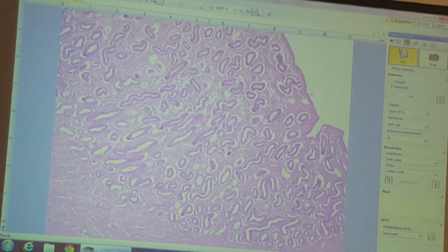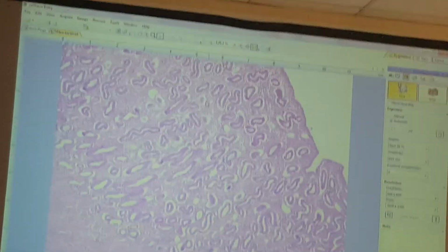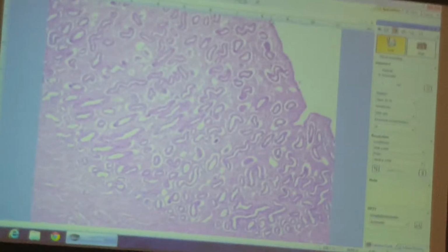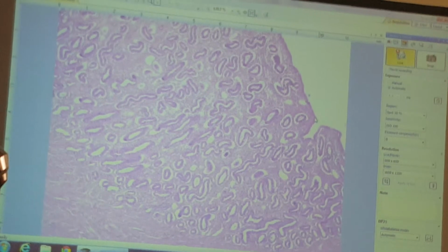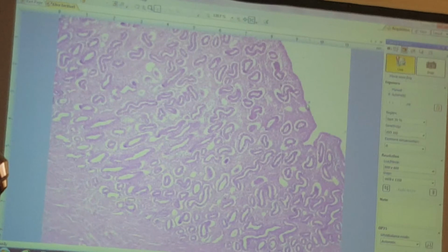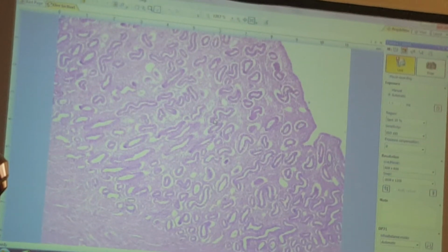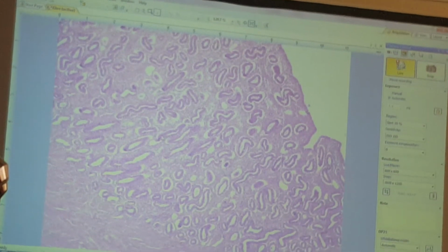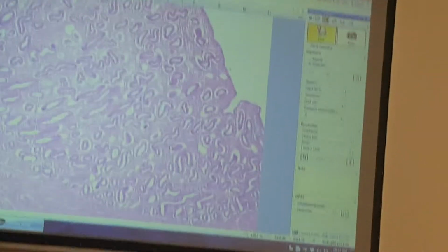And then we come over here and we look at the proliferative phase. So we're rebuilding glands at this point. First of all, notice, here's the uterine cavity, and look, I have a surface epithelium again, which tells you right away it can't be menstrual phase. I see this simple columnar epithelium right here. Every one of these is a uterine gland. A lot of them are long and straight, or little tiny circular profiles. Long glands, fairly skinny.